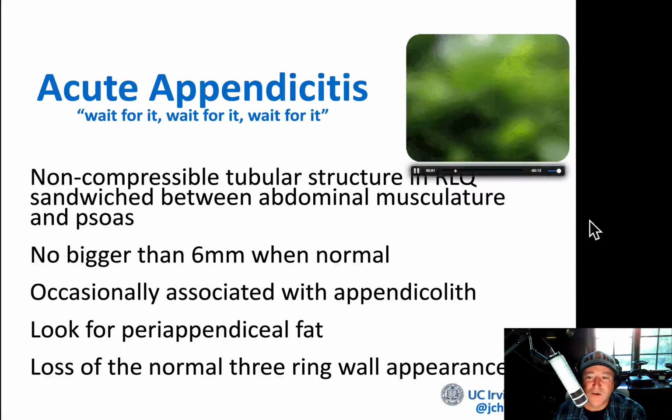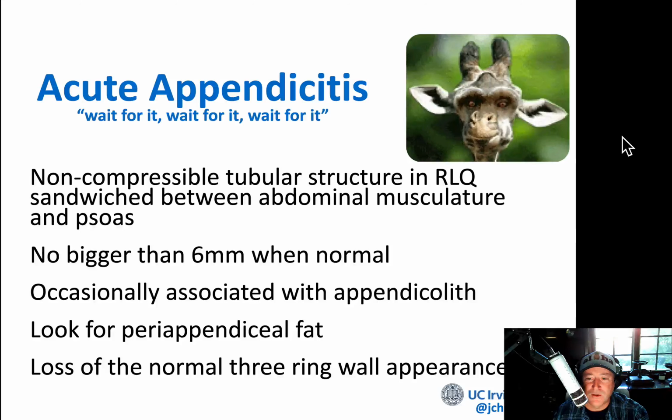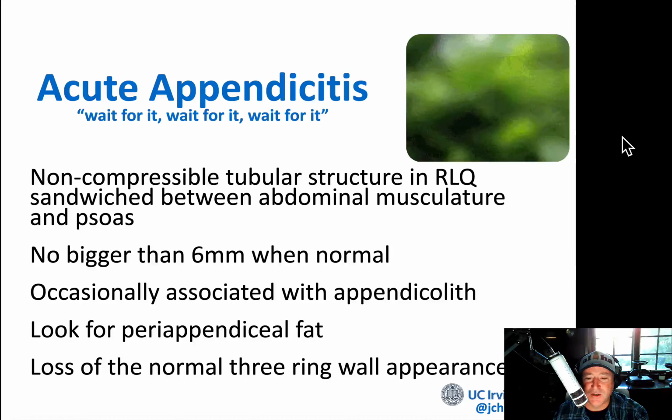Okay, moving on from that into something that's a little bit more difficult, and that's appendicitis. You're looking around for it, you're compressing, looking for a non-compressible tubular structure, you're compressing, and all of a sudden you notice that there it is, and then it's gone again. And so that's the funny thing about appendicitis. It definitely requires a little bit of time.